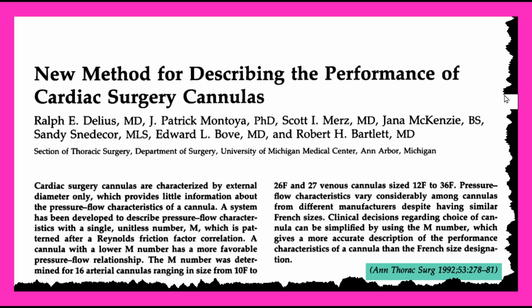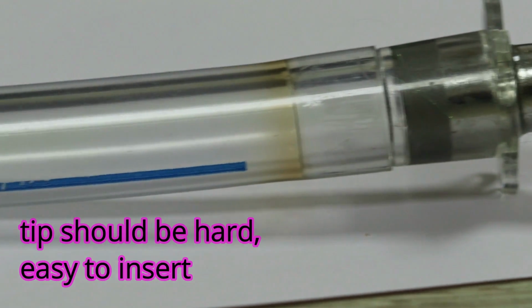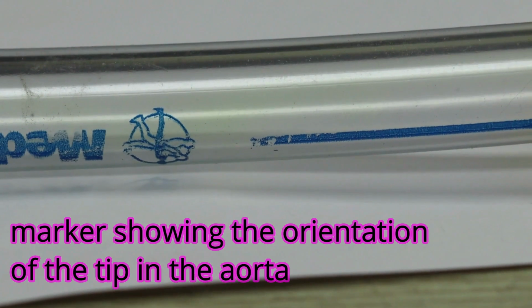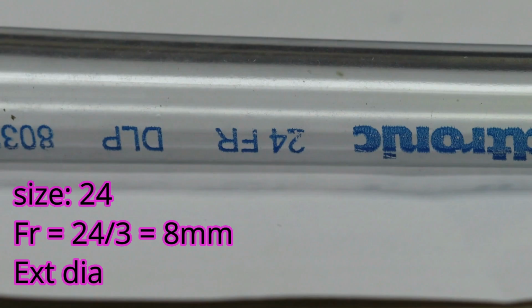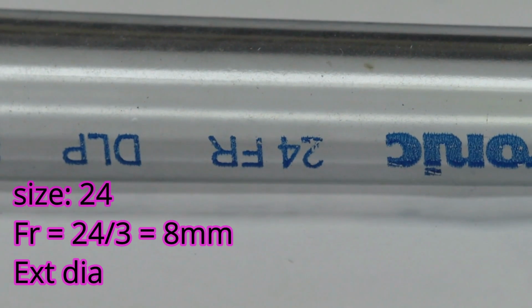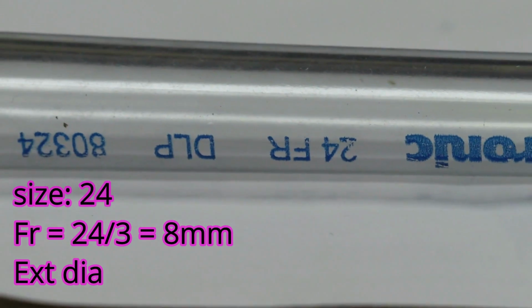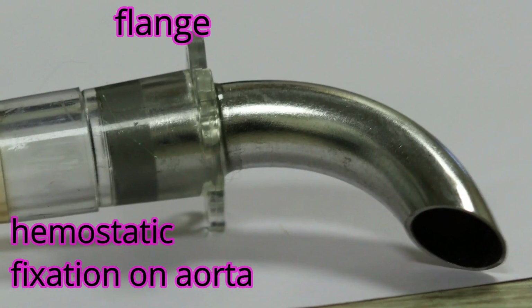Now coming to a right angle tip cannula, especially with the steel tip, there is an importance of something called the ID/OD ratio. A better ID/OD ratio would give rise to a greater flow at the tip of the cannula with lesser pressure gradients and lesser hemolysis. A connector or a flange on this arterial cannula is meant to be hemostatic.